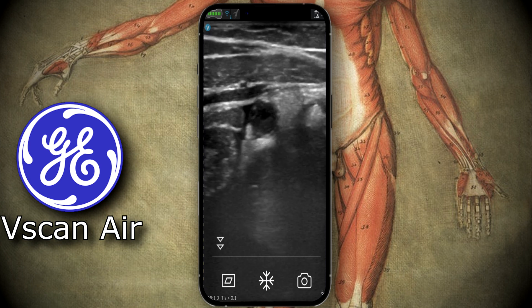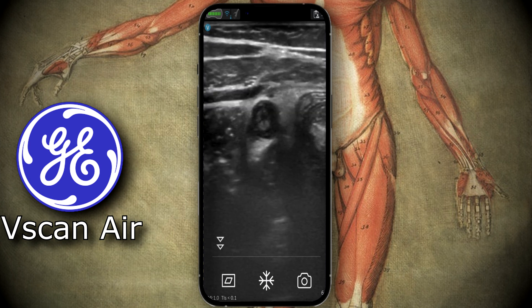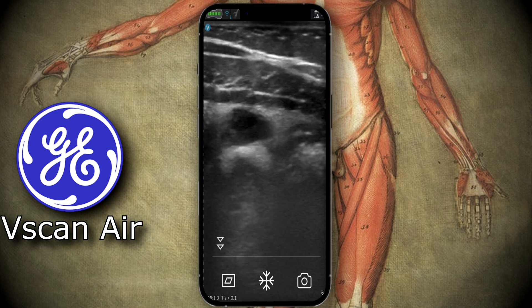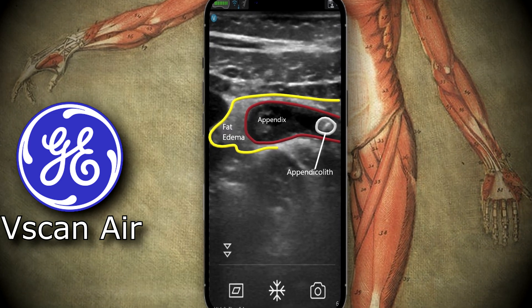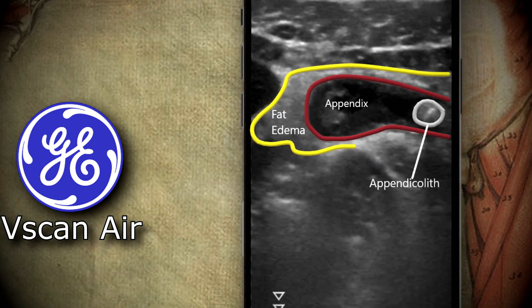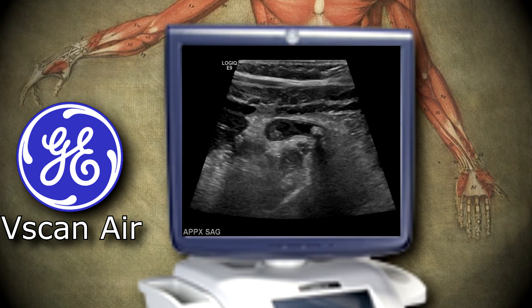There's a tiny bit of free fluid and fat stranding. Let's turn it to sagittal so we can see most of the appendix — there's the tip. You can see the appendicolith. The images were very comparable to the GE Logiq 9 — here's an image from the GE right there.